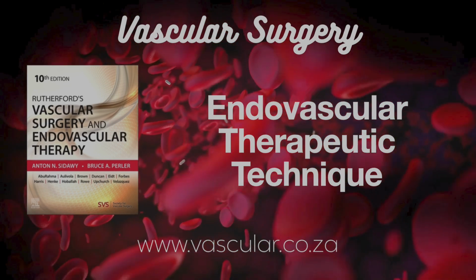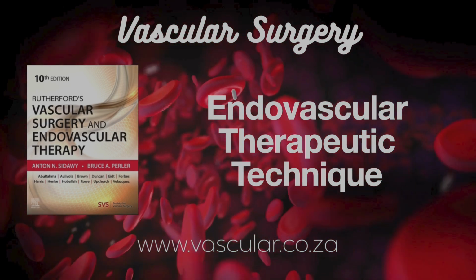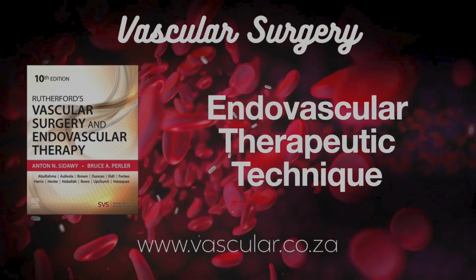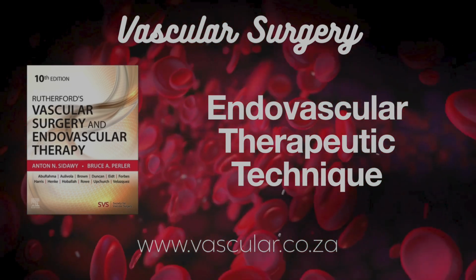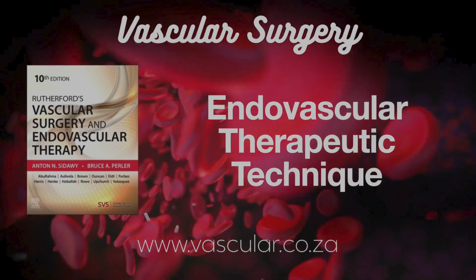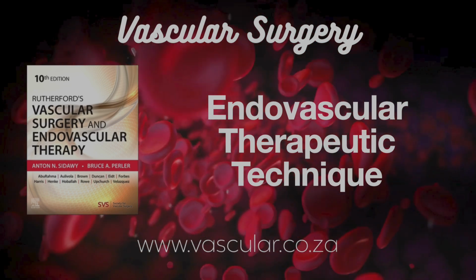So DES tech is finding its place in peripheral disease now. Okay. Shifting slightly: multi-layer flow modulator stents. Sounds specialized. Very specialized, you're right. MFM stents from Cardiatis are designed specifically for treating peripheral and visceral aneurysms, but with the goal of keeping blood flow to important side branches that might come off the aneurysm. How do they do that?